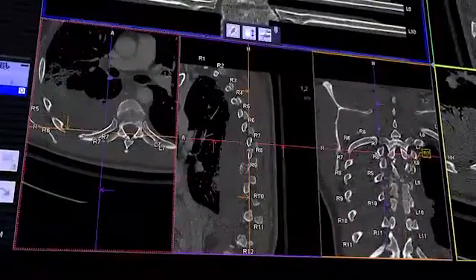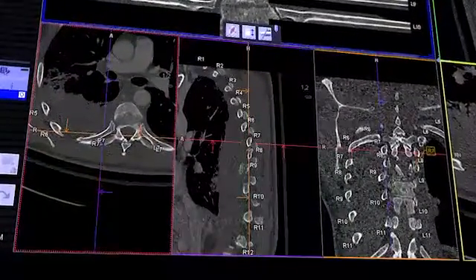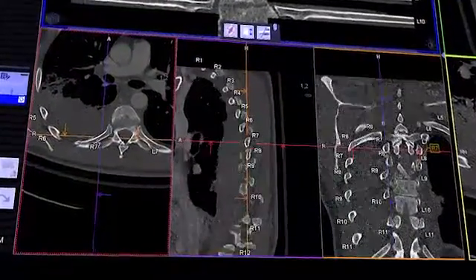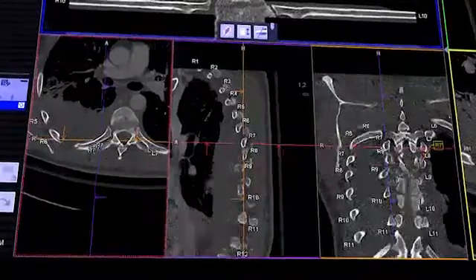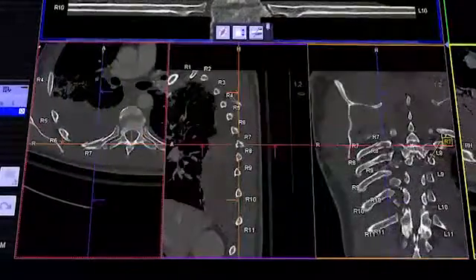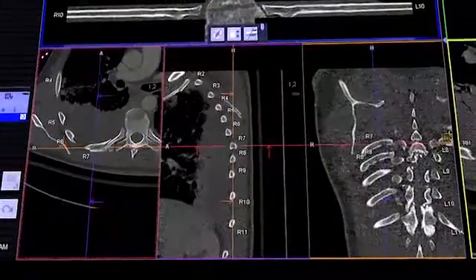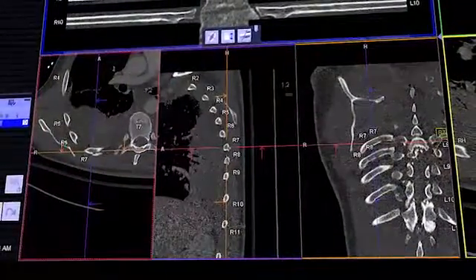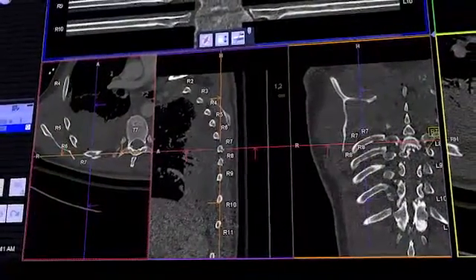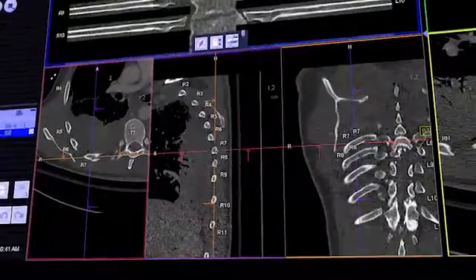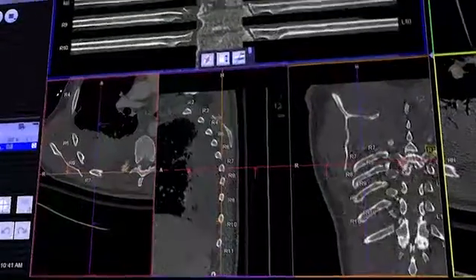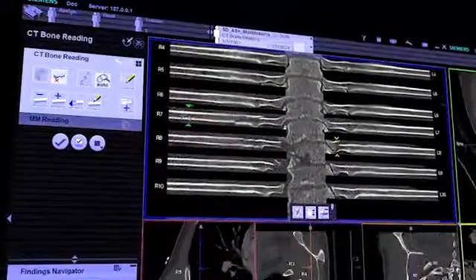As you move along the rib, the axial, sagittal, and coronal views are updated in real time. Thus, the detection of several fractures of the same rib is facilitated.